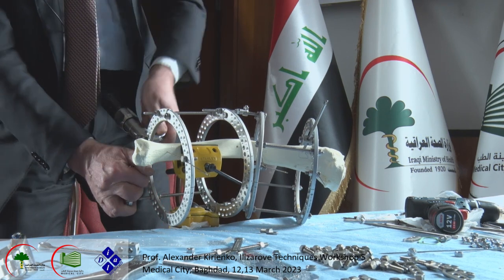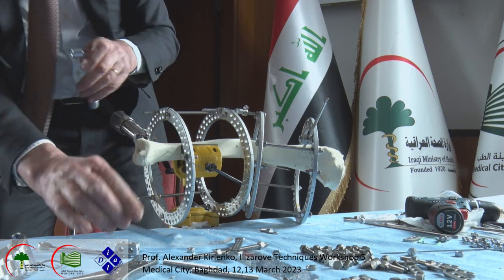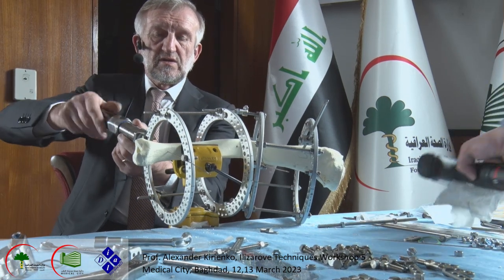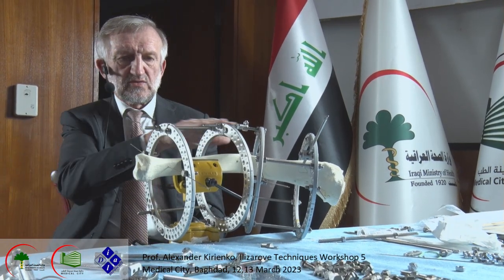Okay, now you see, I tighten it. And the frame now in lateral view is realigned perfectly. Like we said, this is only a one plane deformity, varus, no procurvatum.